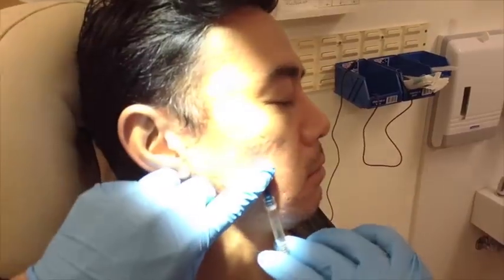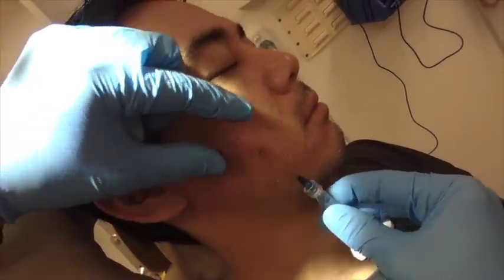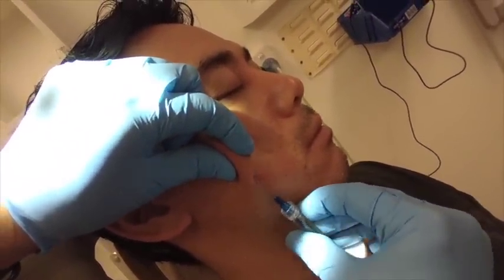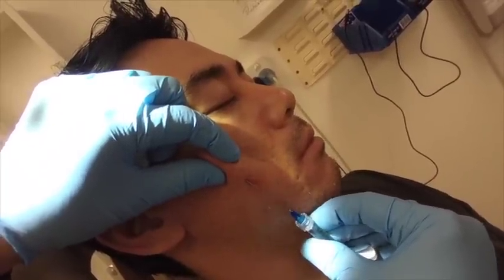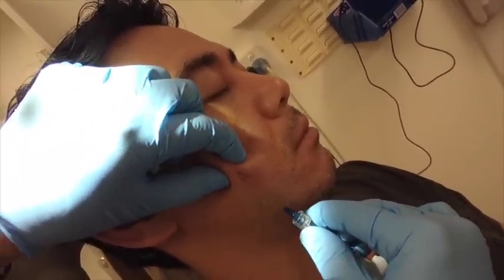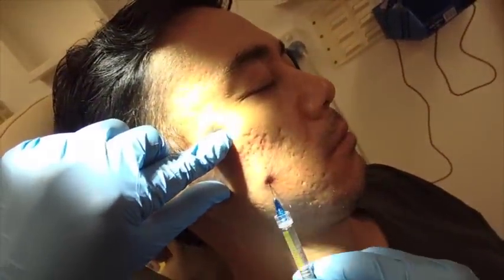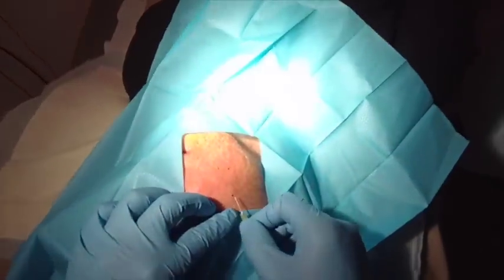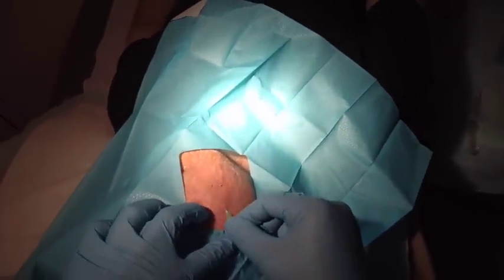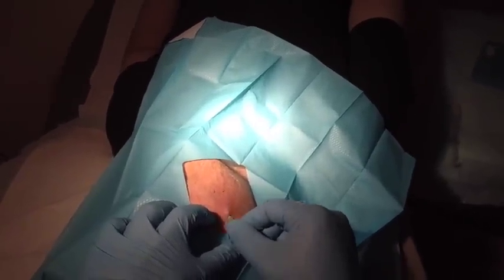With cannula subcision you can add anything to the syringe — most of the time I use saline because most of the scars are attached. I use what I call multi-level cannula subcision — I coined that term. I can't write these down in my notes because they're not accepted by my peers yet and the literature isn't great for it. However, the 1995 paper is the paper to go to.